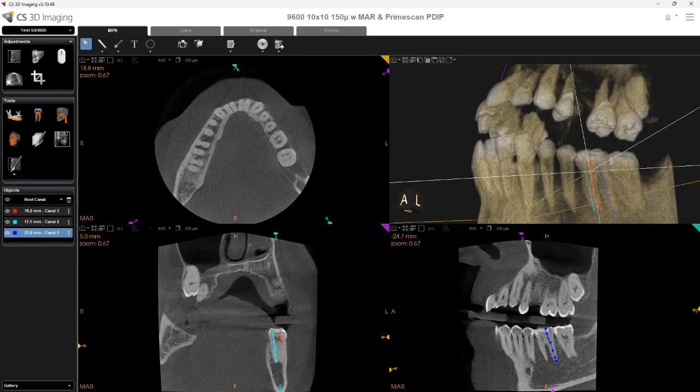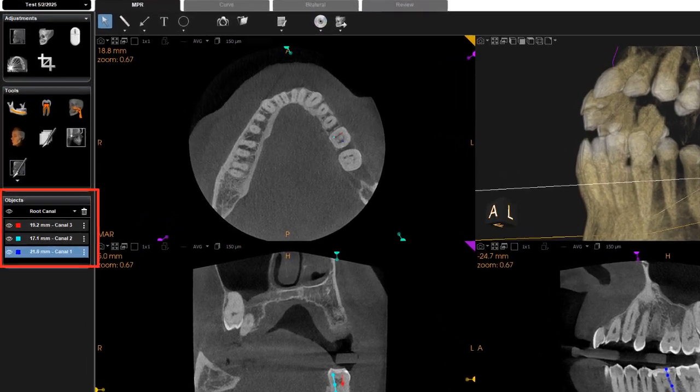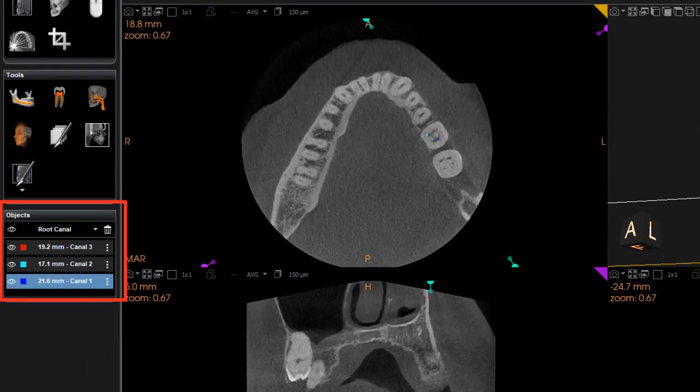The traced canals are also visible in all view panes. The information for each tracing is listed under the Objects menu. Click the ellipsis next to a tracing to delete it or to edit.